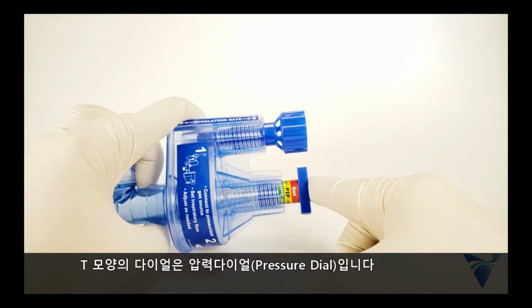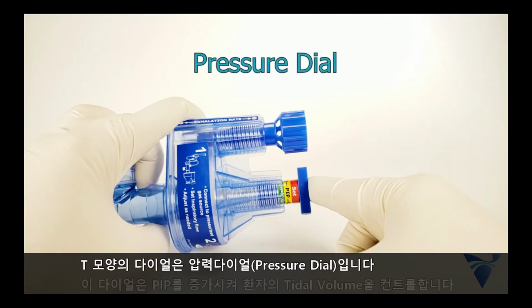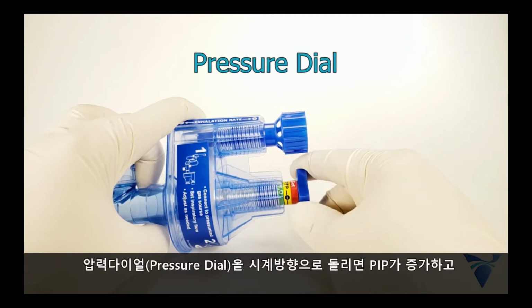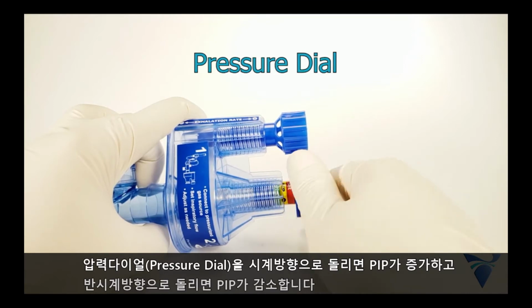The T-shaped knob is the pressure dial. This dial controls the patient's tidal volume by increasing peak pressure. PIP is increased when the dial is turned clockwise and decreased when the dial is turned counterclockwise.